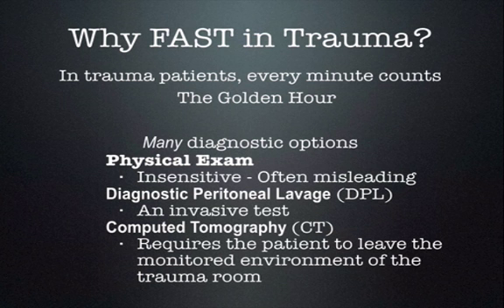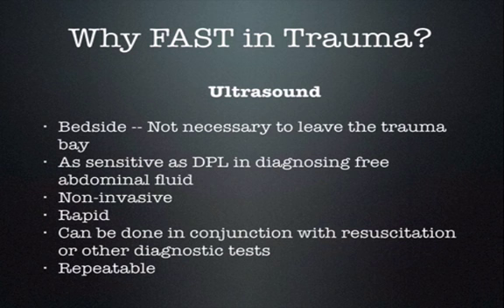Diagnostic peritoneal lavage gives similar information to the FAST exam in diagnosing free intra-abdominal bleeding. However, it is an invasive test and does have some morbidity and mortality. Computed tomography is an excellent choice. It does give you very specific diagnoses of what's going on in the trauma patient. However, it does require the patient leave the monitor environment of the trauma room.